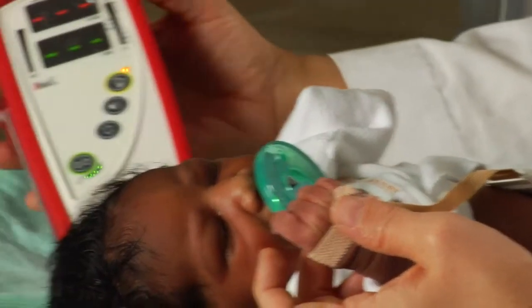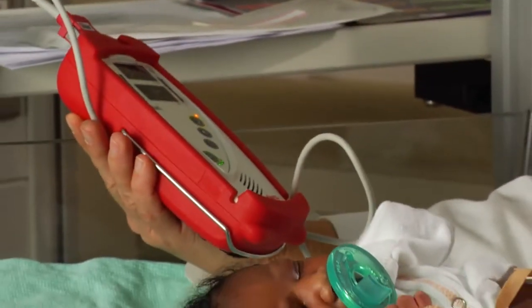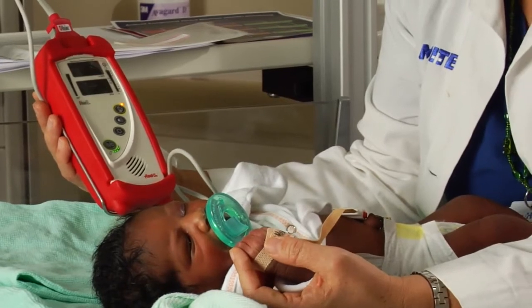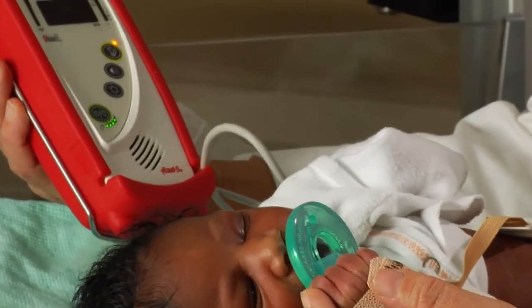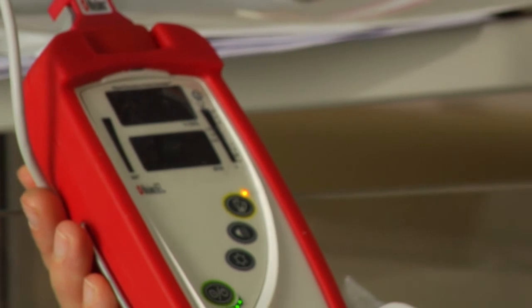Once it's on, you may need to wait for a little while for the pulse oximeter to measure the reading. As I said, this can take a while. And in our nursery, we generally advise waiting at least 1 to 2 minutes before we obtain a reading. Often it can take a little longer.